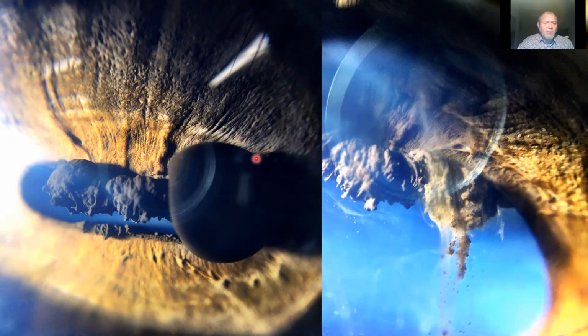It also illustrates the importance of having a black lens. This is a close-up of the anterior surface of a horse's iris. It's got an iris cyst in this eye. And this is just before and after laser photocoagulation. We've just heated up the cyst wall with a laser, and you can see individual cells dropping down through the aqueous as the cyst dissolves. You can see this white reflection on the eye, which is actually from this silver macro lens. If it were a black macro lens, we wouldn't have seen those rings. One of my favourite photographs.